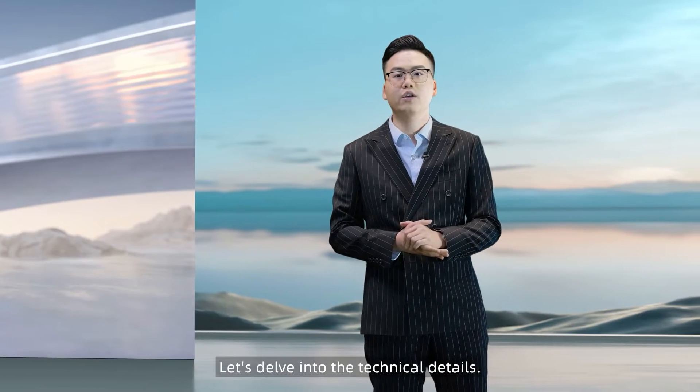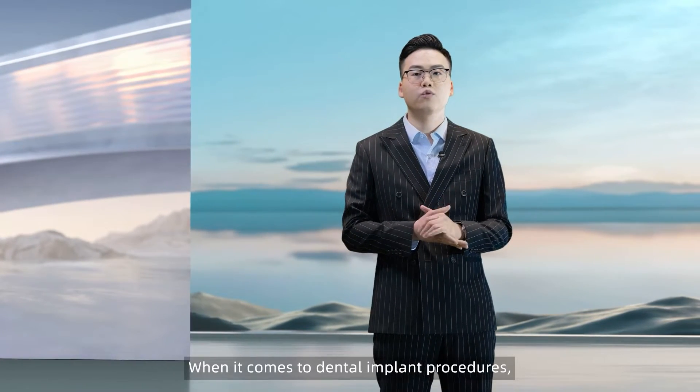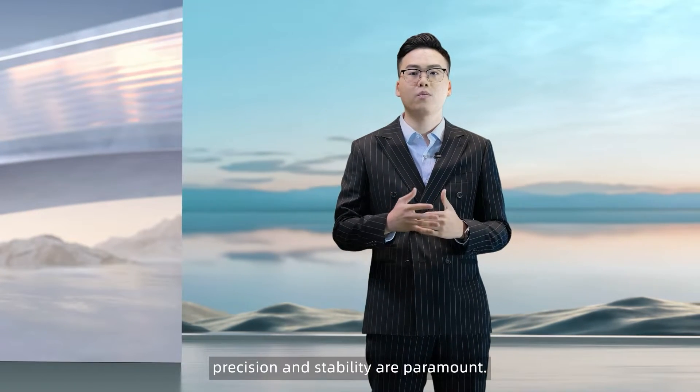Let's delve into the technical details. When it comes to dental implant procedures, precision and stability are paramount.